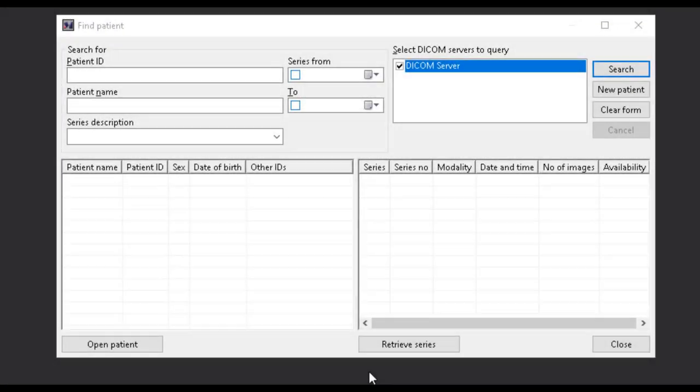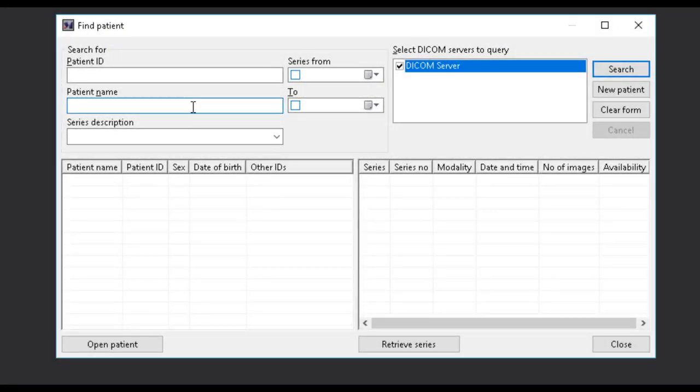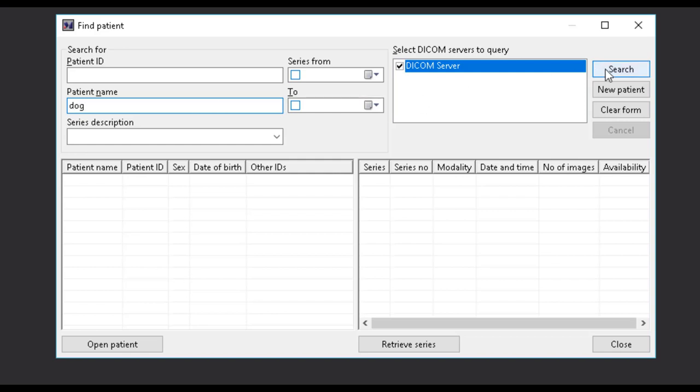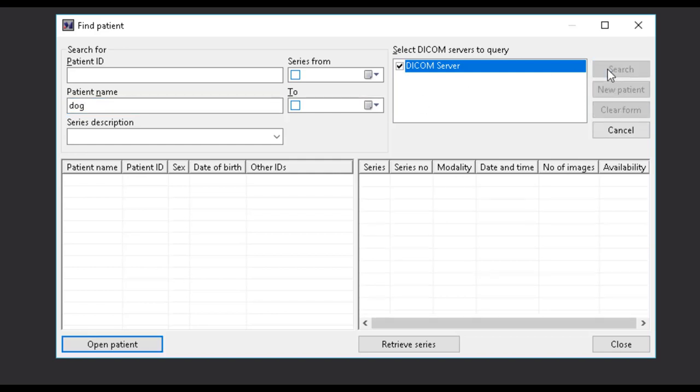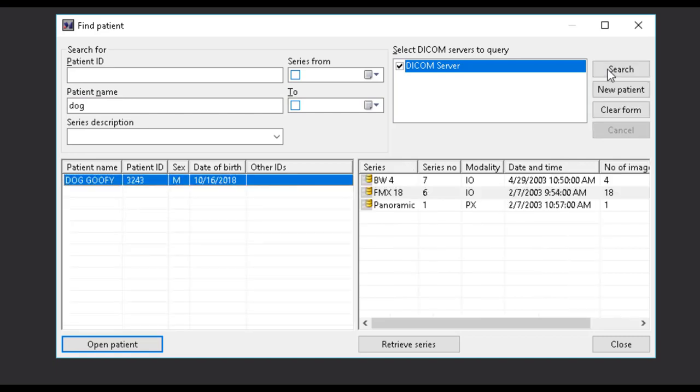Before you can acquire images, you must first find the patient record. You can search on patient ID, patient name, series description, and when the images were taken. Once you have filled out the criteria for your search, select the search button to retrieve your results.